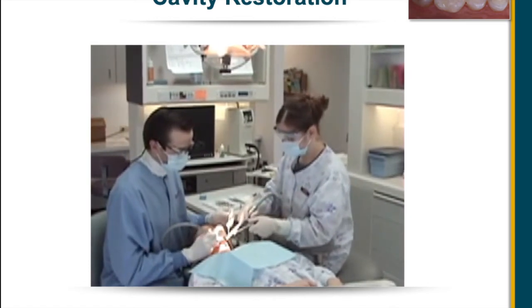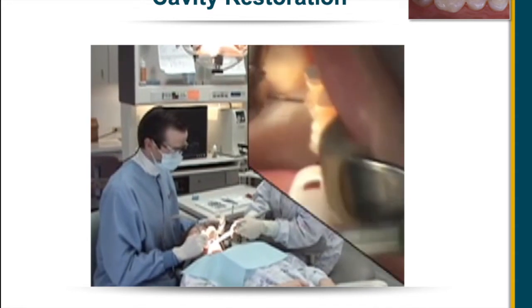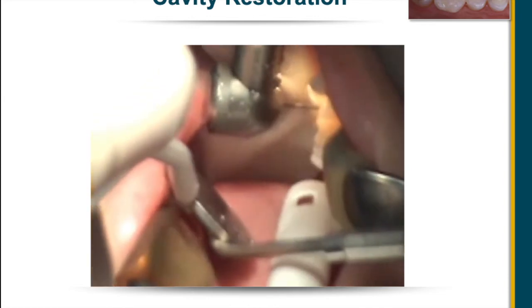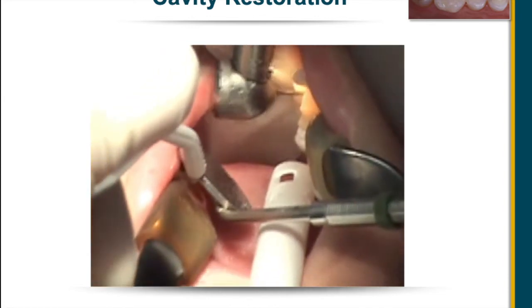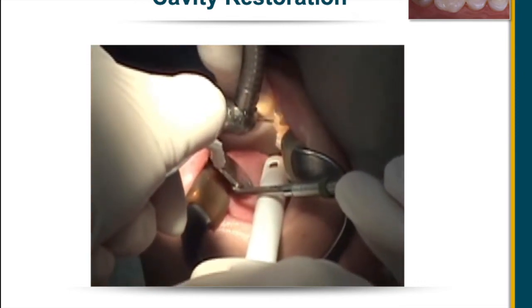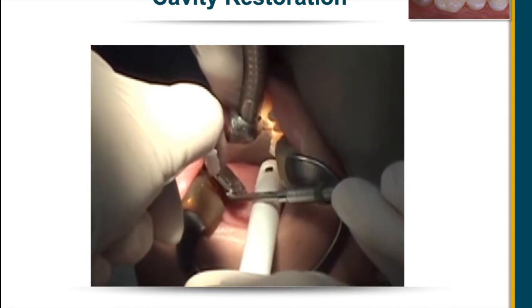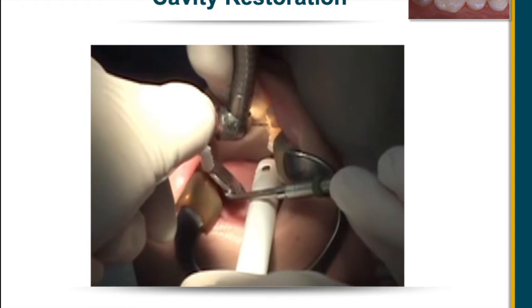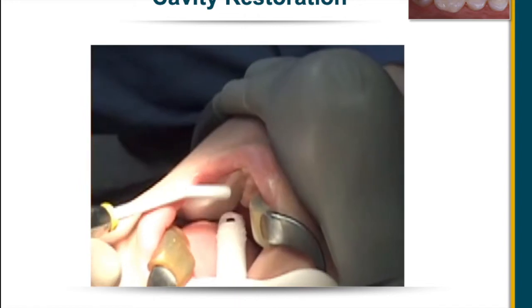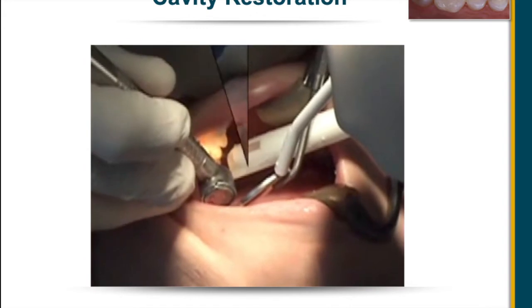Again, note the positioning of the patient, the doctor, and the assistant. This is a view from the assistant's point of view. Notice the air-water blowing, or just the air blowing right over the mirror to eliminate the water spray from blocking the view of the dentist. The high volume suction, in this case, is underneath the mirror. And again, the doctor leaves and the assistant moves in and air-waters the prep.